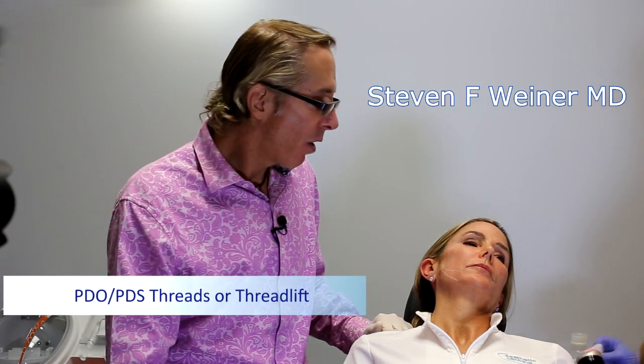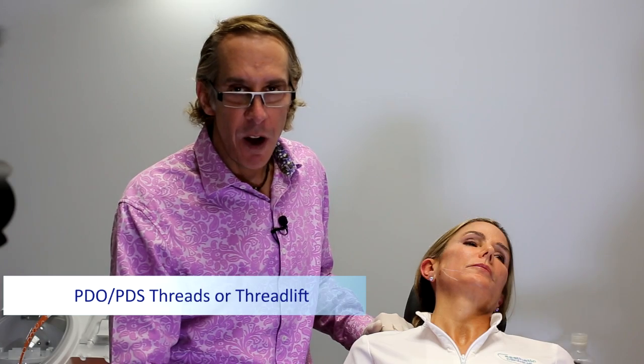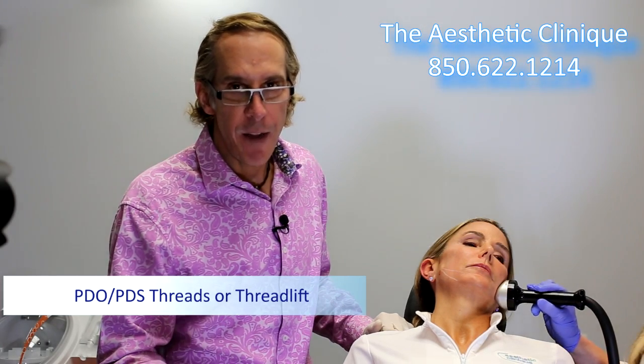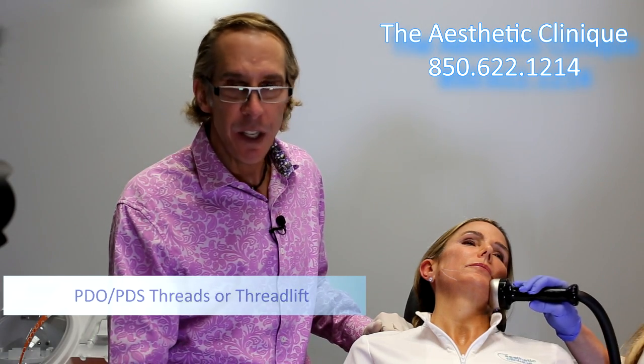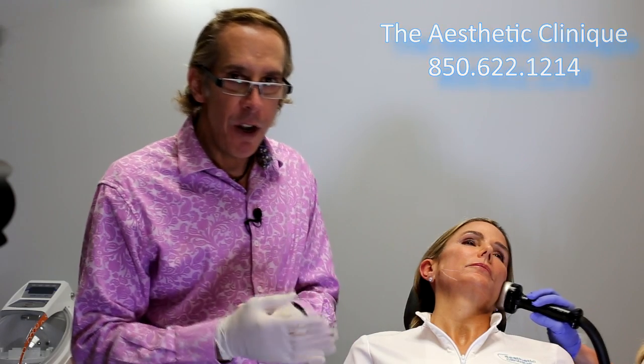Today we're going to talk about PDS threads. So PDO threads are these threads that have been used in operations for at least 30 years, particularly in cardiac surgery. So they're not new to the medical world. But what is new is the use of these threads for cosmetic uses. And what you do is you have 4 different types of threads that are used, and they were developed in Korea as well as in Europe, and they're very popular there now.